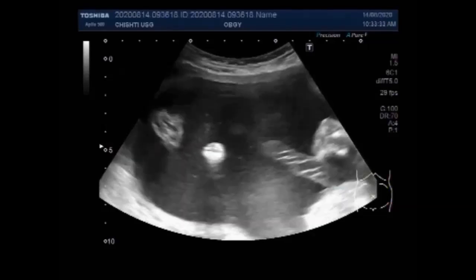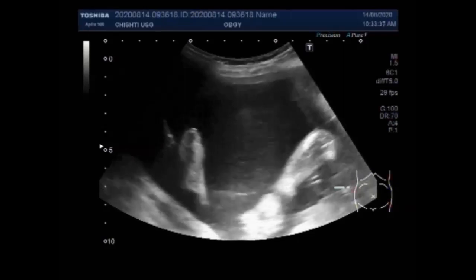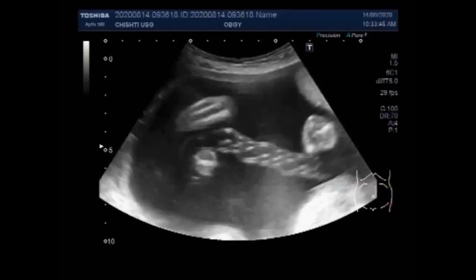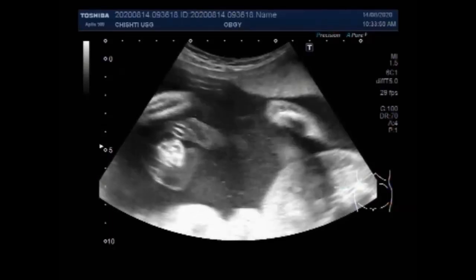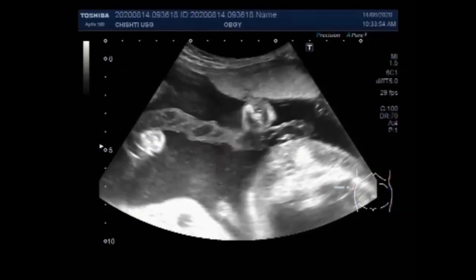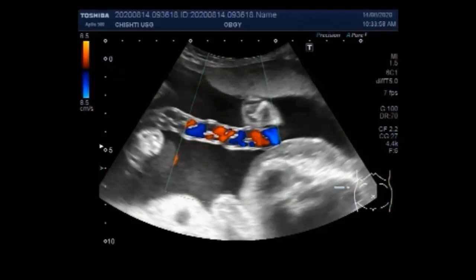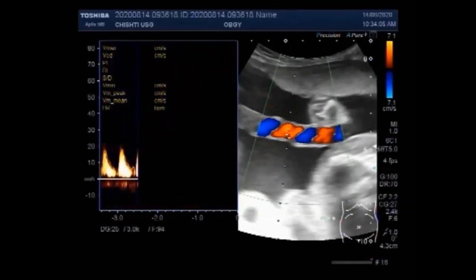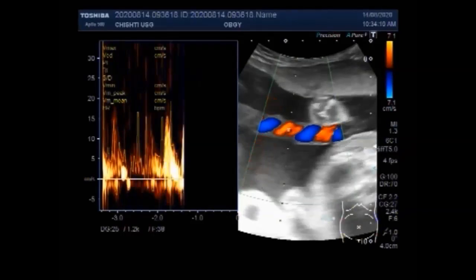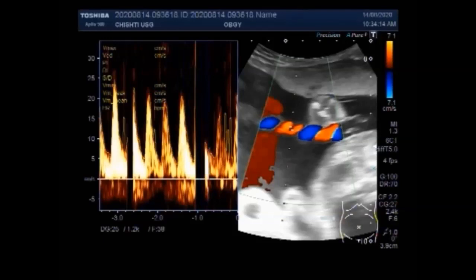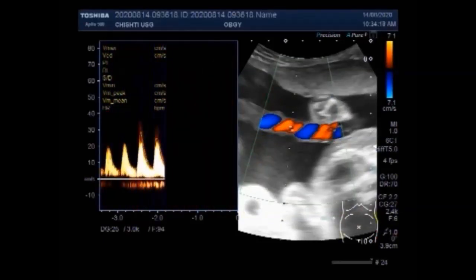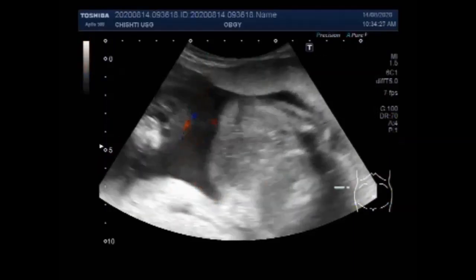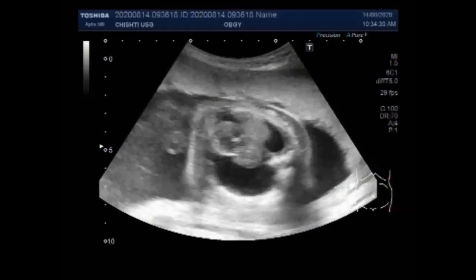You can see the amniotic fluid is increased in volume. The number of babies who develop immune hydrops fetalis has dropped due to a medicine called Rhogam. This drug is given as an injection to pregnant mothers who are at risk for Rh incompatibility. You can see the umbilical cord — blood flow is also visible. Rhogam prevents the mother from making antibodies against the baby's red blood cells.